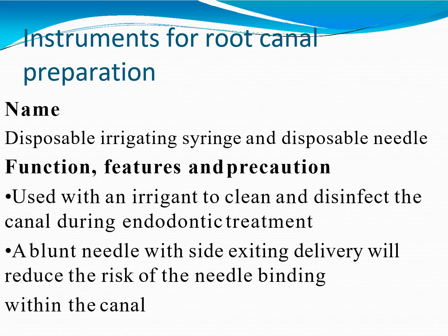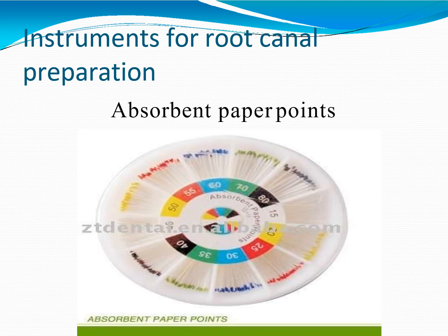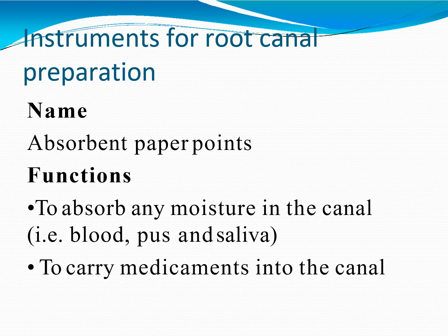The disposable irrigating syringe and disposable needle are used with an irrigant to clean and disinfect the canal during endodontic treatment. A blunt needle with side-exiting delivery reduces the risk of the needle binding within the canal. Absorbent paper points are used to absorb any moisture in the canal — including blood, pus, and saliva — and to carry medicaments into the canal.